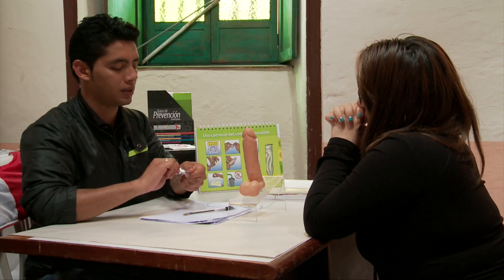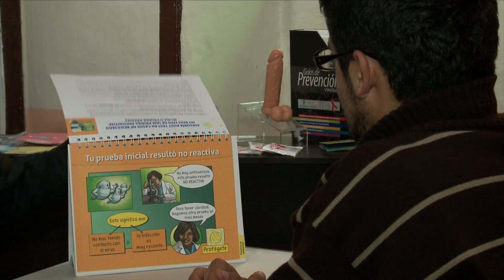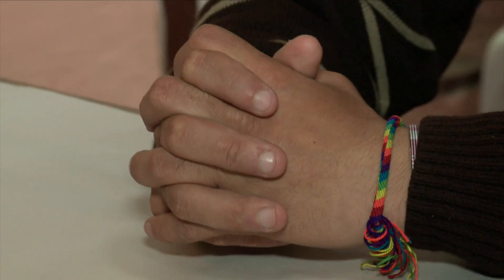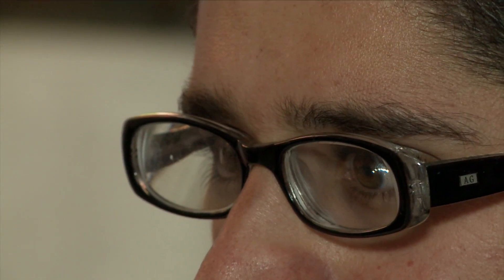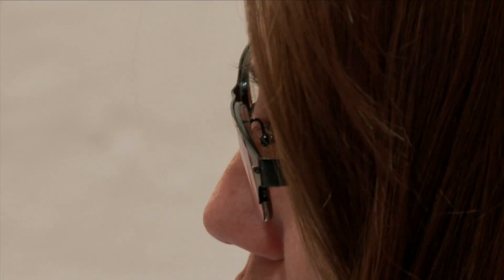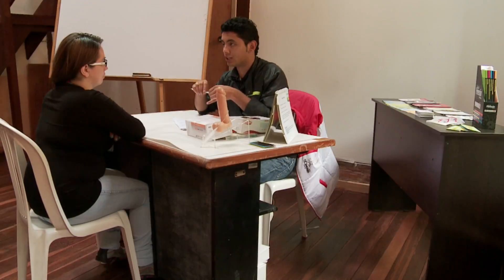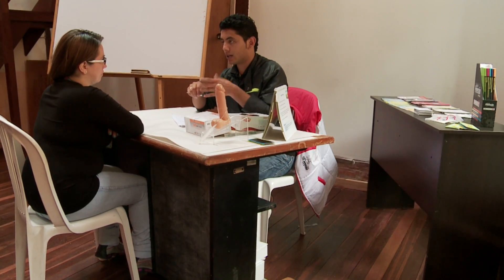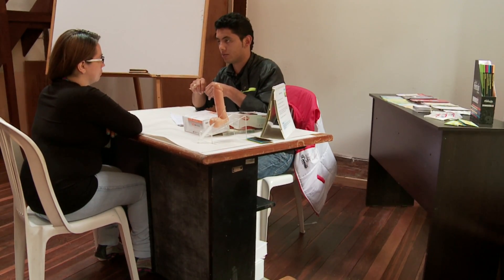Además, es fundamental resaltar que una sola prueba negativa no descarta la infección. Ante una prueba inicial no reactiva para VIH, siempre se requiere repetirla tres meses después, para descartar un posible periodo de ventana. El periodo de ventana es el tiempo que tarda el cuerpo en producir los suficientes anticuerpos después de una exposición de riesgo para que la prueba resulte reactiva. Es en promedio tres meses.